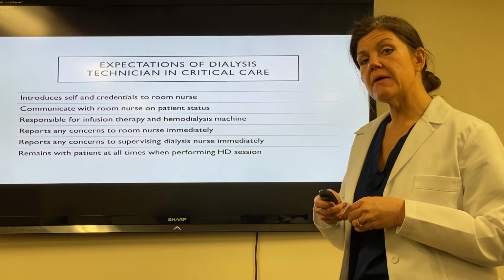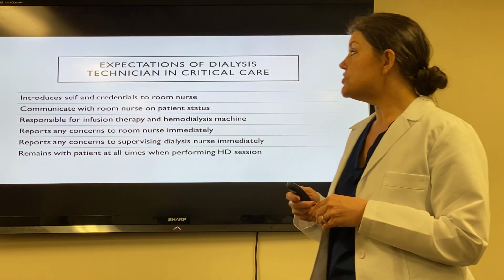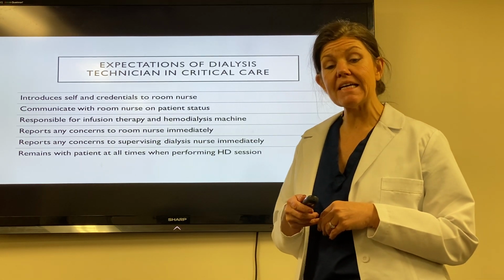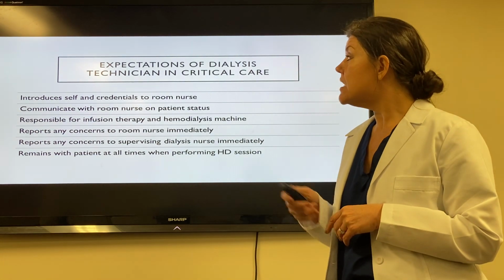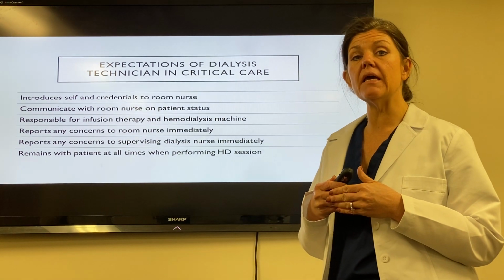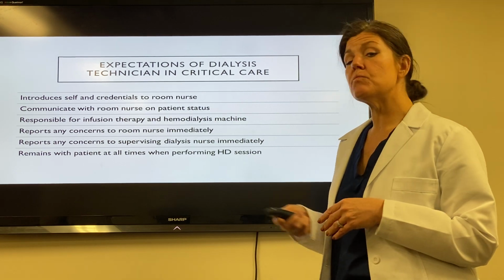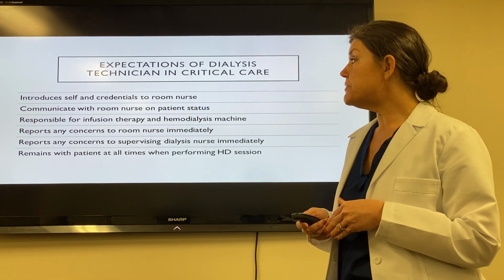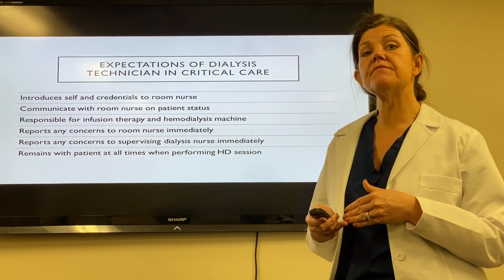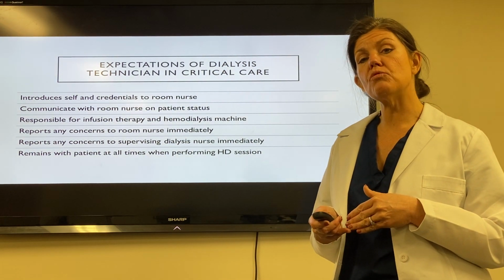So now let's talk about the expectations of the dialysis technician in critical care. The dialysis technician should introduce himself with their credentials so that the room nurse knows that they are a technician and not indeed a dialysis nurse. They should communicate to the room nurse on the patient's status, as the patient's nurse should communicate the patient's status to them. They are responsible for the infusion therapy and the hemodialysis machine. They should be reporting any concerns to the room nurse immediately and contacting their supervising dialysis nurse if they have any problems. They must also remain with the patient at all times when they're performing the hemodialysis session.